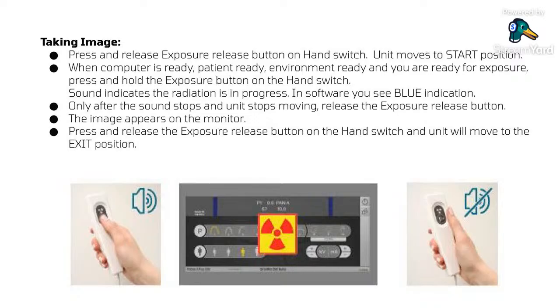In the beginning, when people do not know it, the radiologist does not know it, they're still in the learning phase, they just press it. So make sure you do not do that. You press and hold the exposure button. You will hear a beep sound. This means that the radiation is in progress. Okay. In the software, you will see this as a blue indication.